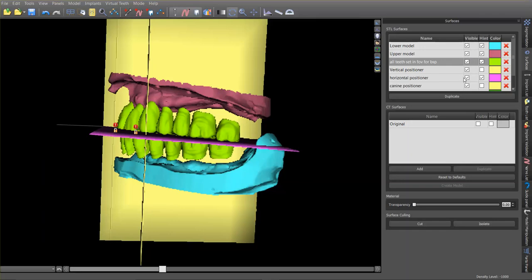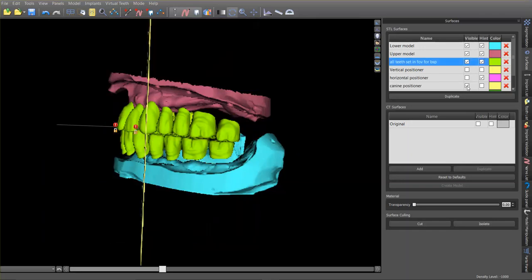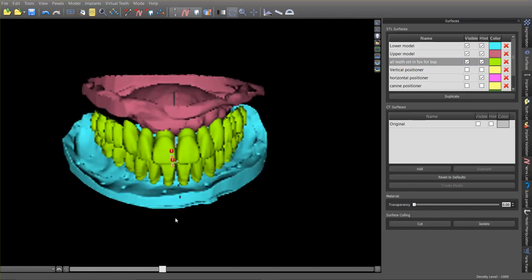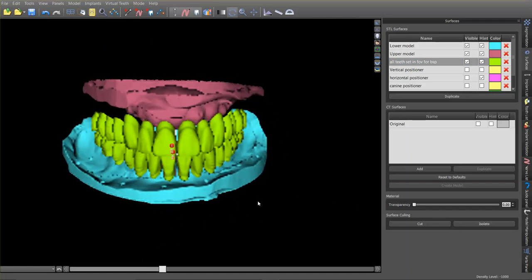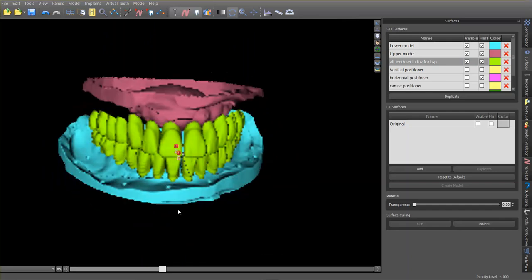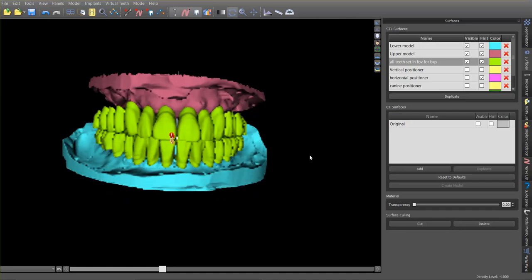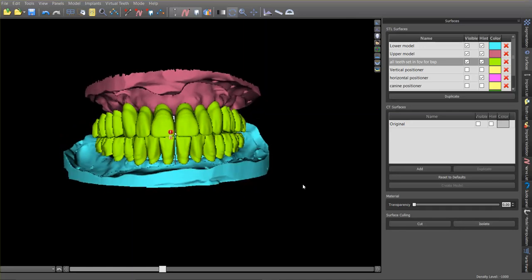Now I can turn off all of these planes — we don't need those at this point — and the teeth are positioned correctly within the arch. The lower teeth need to sit directly over the ridge for denture stability, and that automatically defines where the upper teeth are going to be.